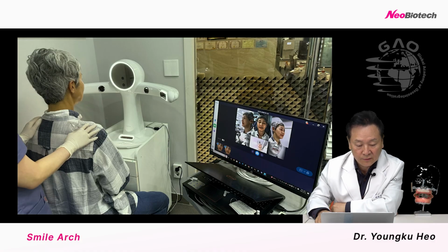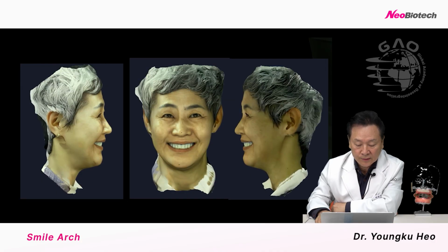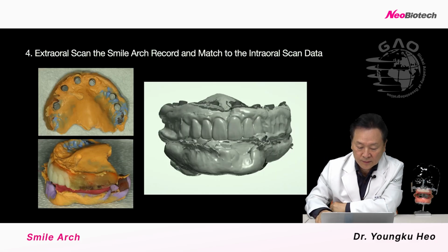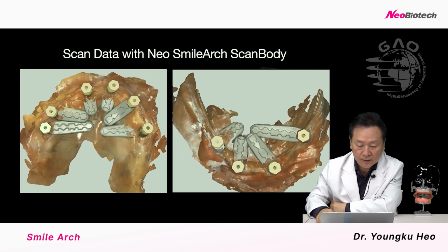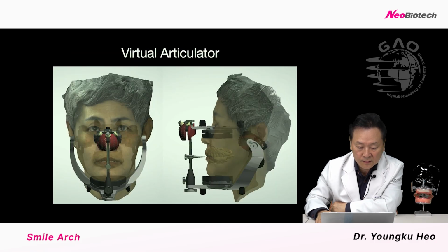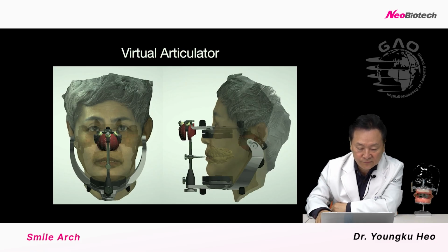We take the face scan, smile. We're matching everything together: intraoral scanning data, also the smile data. We're matching everything together, and also importing this into the virtual articulator.